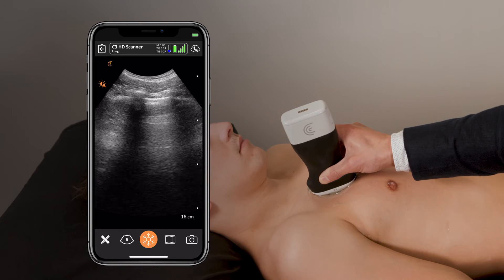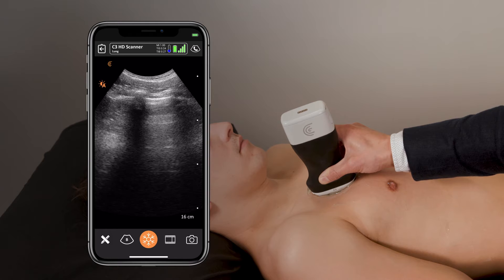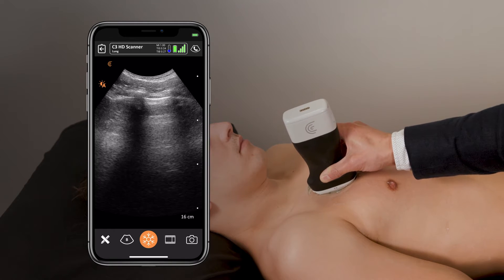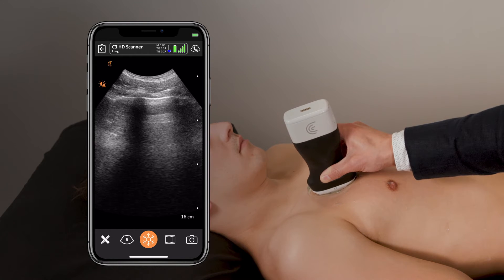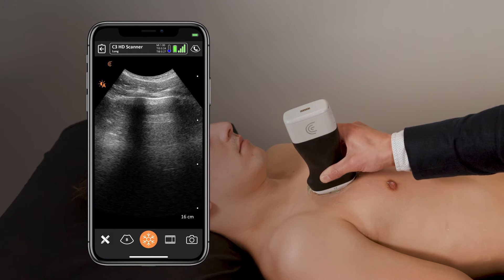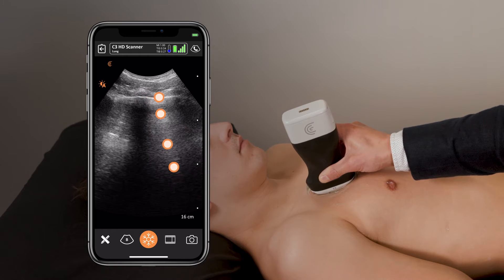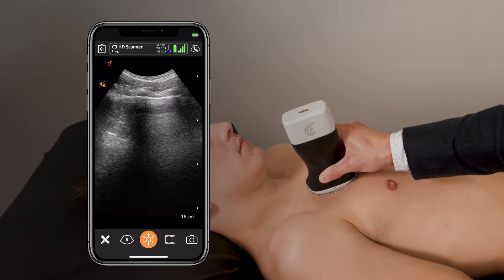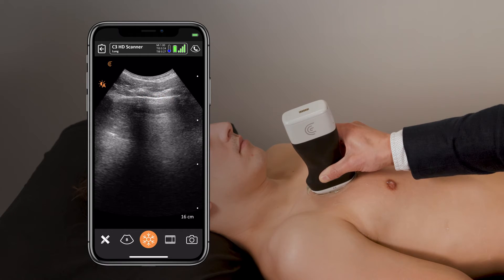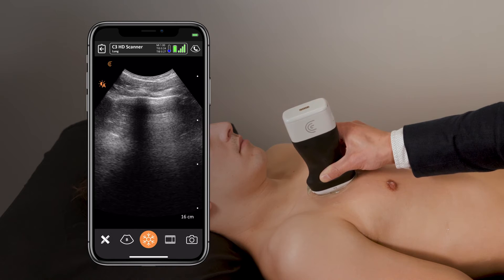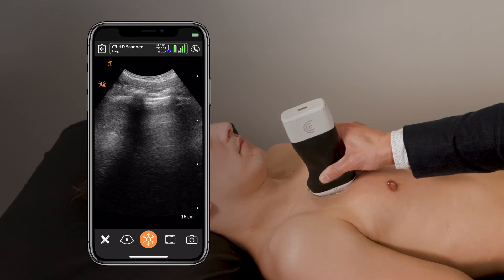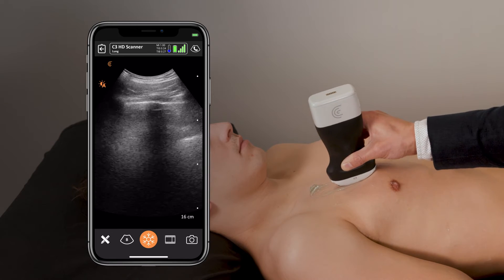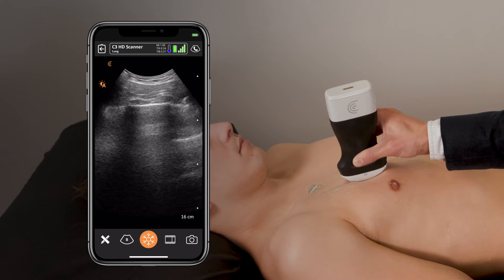We want to visualize normal sliding at the pleural line at multiple interspaces. Normal aerated lung will have horizontally-oriented reverberation lines called A-lines that go deeper into the screen, and that is essentially normal. We'll start here in the upper lung zone on the anterior aspect of the chest and scan downwards.